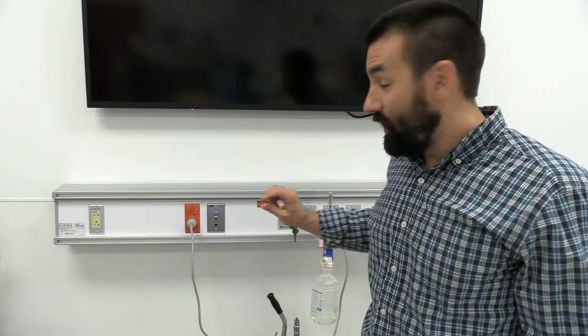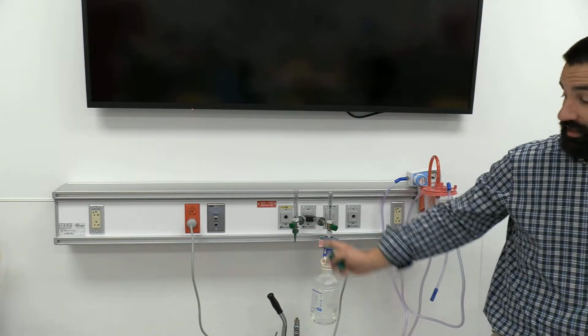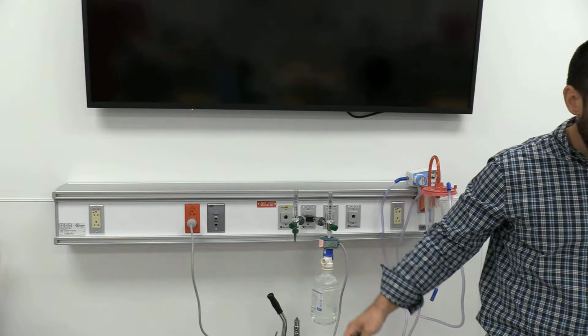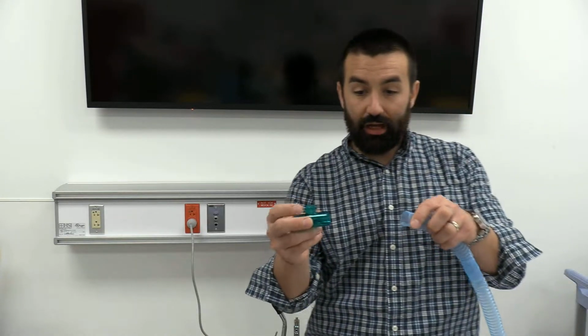Now, if we did have an adjustable one, and we could adjust the temperature of the gas coming out of this, we don't care so much what the gas temperature is right there as we do as it's getting closer to the patient. So we want a means of checking the temperature close to the patient. You just take another little T-piece or Briggs adapter here. You take a little thermometer, and put it.